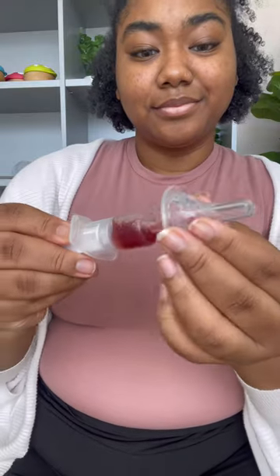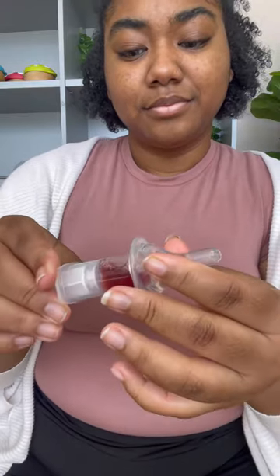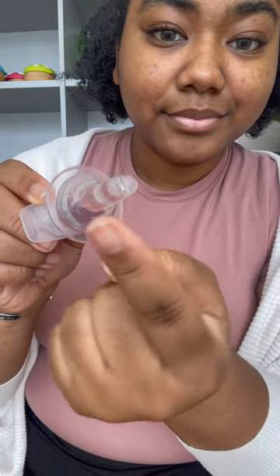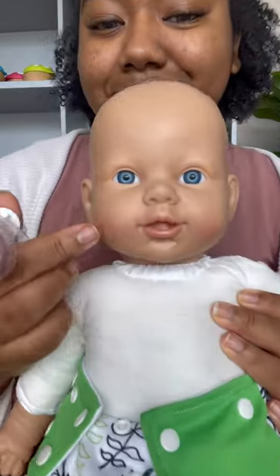Now you're going to pop the silicone tip back onto the syringe so it's nice and soft for your baby's mouth. The silicone tip also has two holes, so when you push the medicine into Bub's mouth it goes into their cheeks, not straight back into their throat.